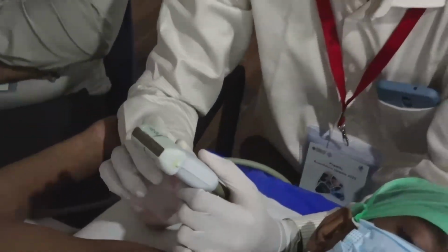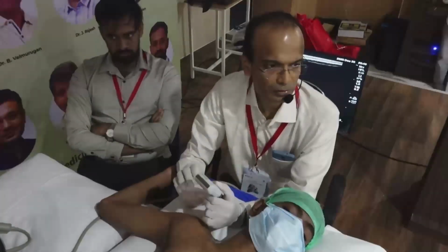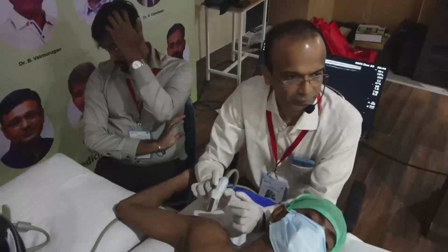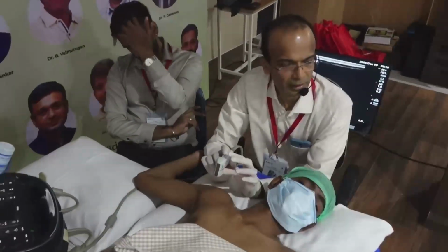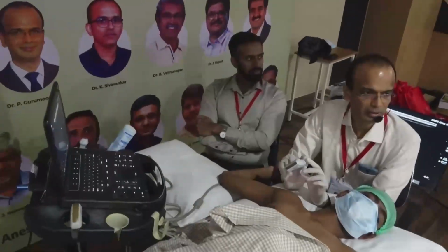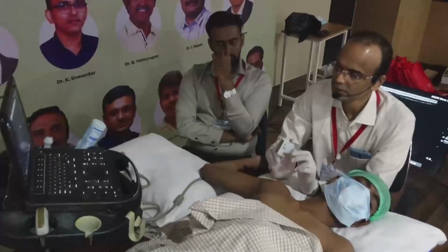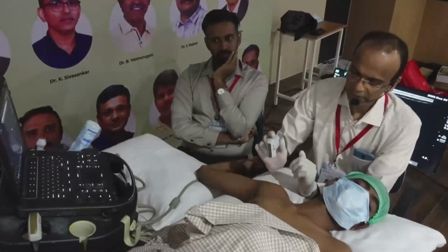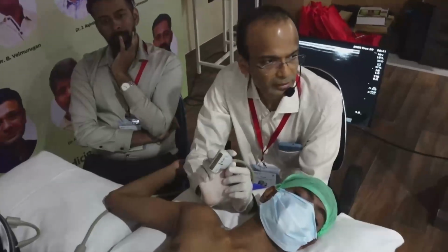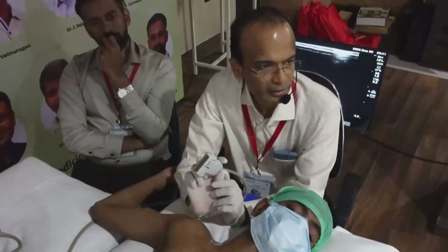COPD compromised, if you want to do proximal humerus fractures, it is possible to infiltrate the skin and do the costoclavicular block, which will cover up to the upper trunk also. Even if you give local anesthetic in the costoclavicular area, slowly it spreads to the upper trunk area. But is there any possibility of avoiding phrenic nerve block completely in costoclavicular?